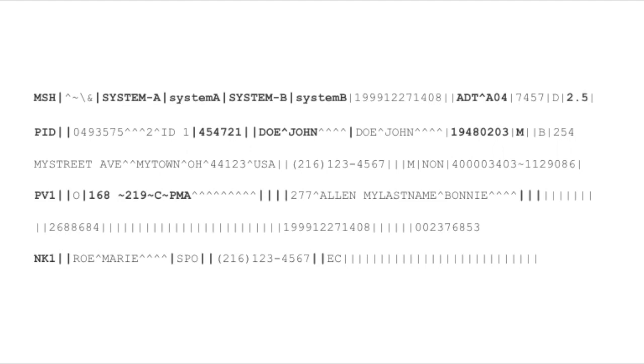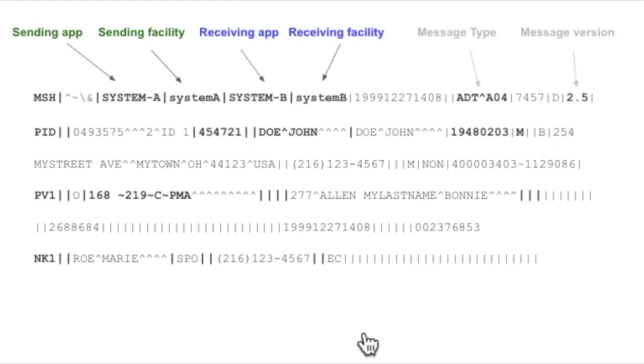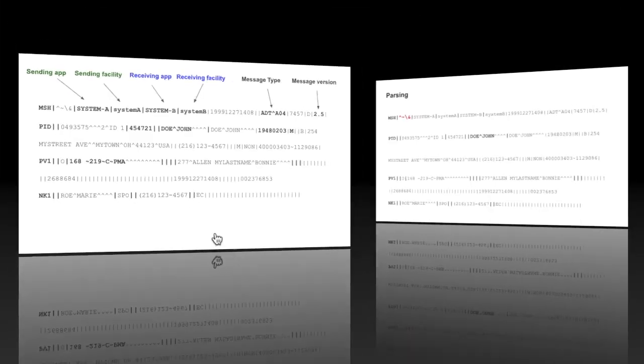Each segment contains specific data. For example, the first one, which is the message header, contains data related to the systems in question. So we have the sending system and the receiving system, plus message information such as the type and version of the message.